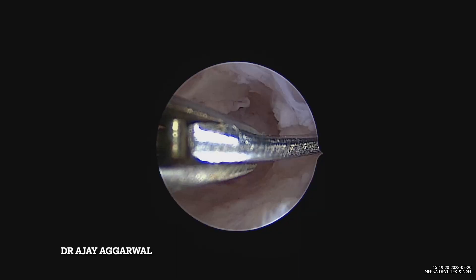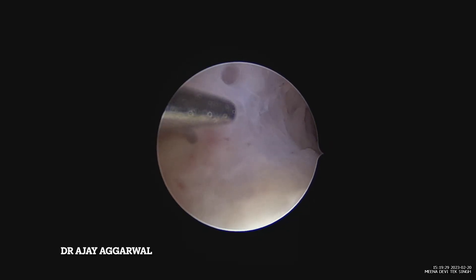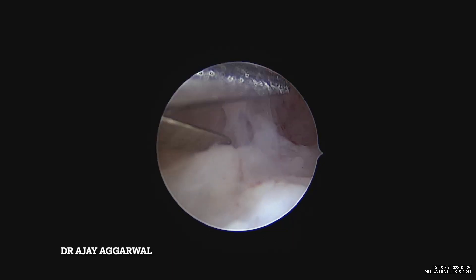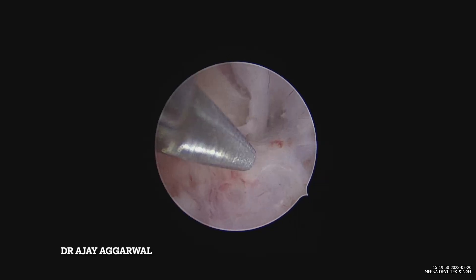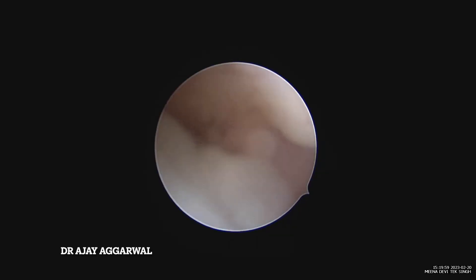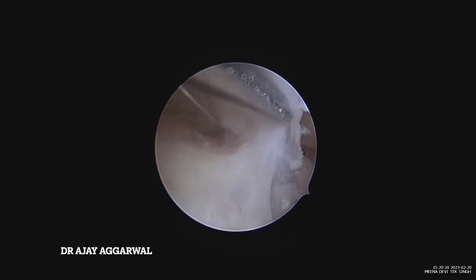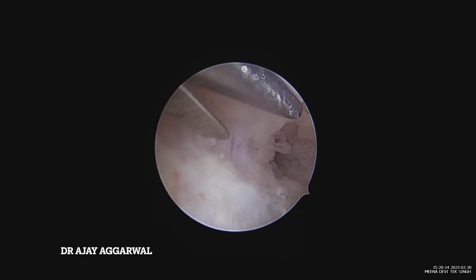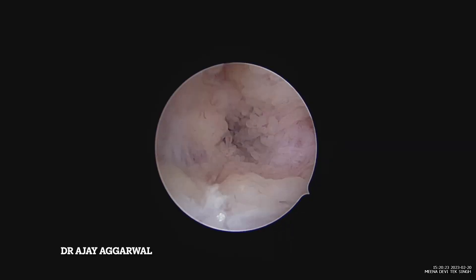I could open up the posterior wall over here. I am going along the lateral wall with small snips so that I can easily identify if I am digging into normal tissue. Going up, I could see the ostia. I open up with my scissor and cut, and the moment I cut I can see the ostia. The ostia is not very healthy — the endometrium on top of it is totally pale, and the normal vascular pattern of the ostia where all the vessels converge is also lost in this case. I am not very happy with this finding.